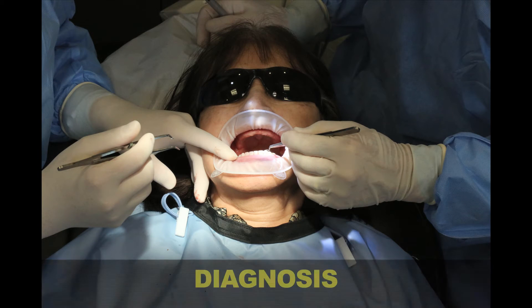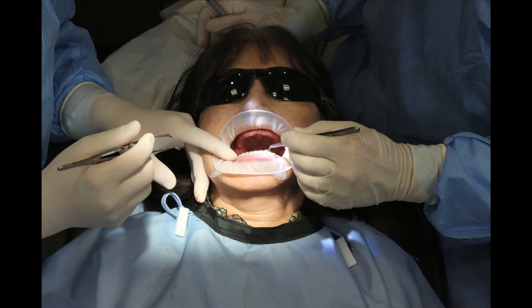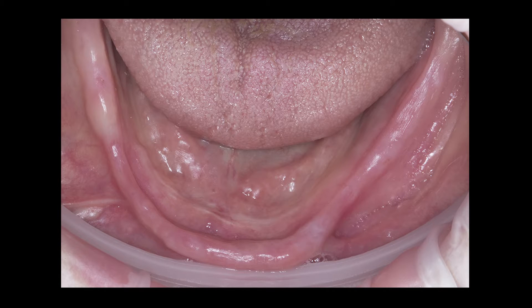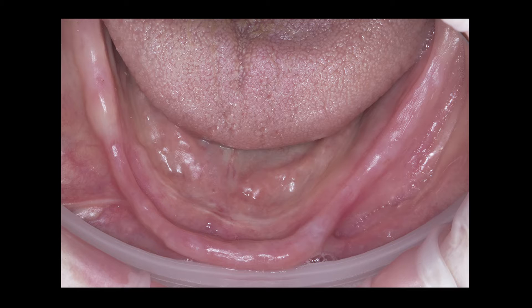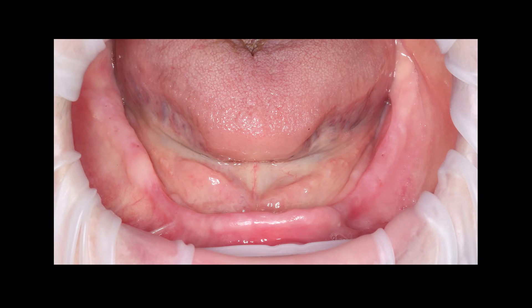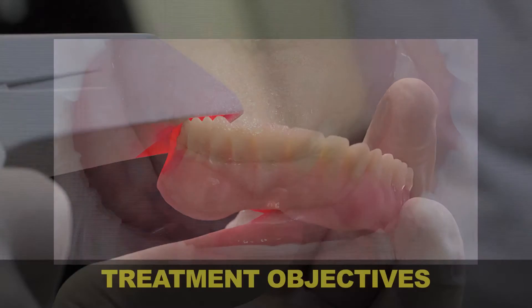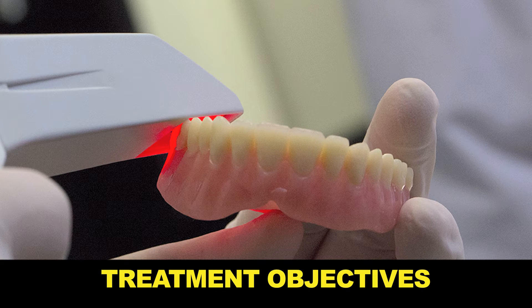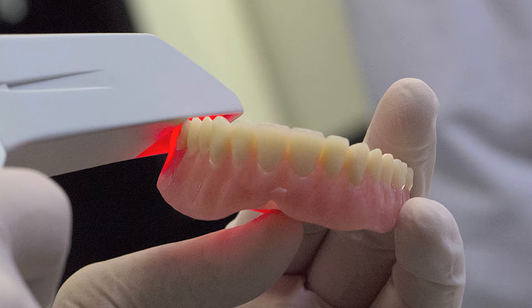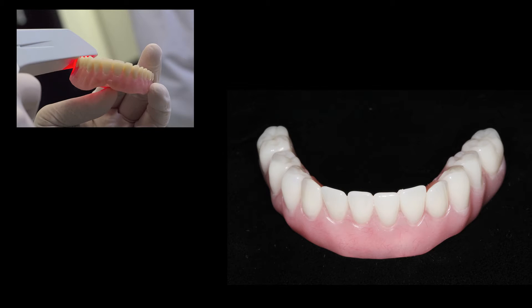Her periodontal tissues were generally healthy and free from irritation or bleeding because of recent reline and adjustment of the lower denture to relieve sore spots. Her occlusion with the relined dentures was good, and she had been functioning in these dentures for years without any TMJ issues. The objective of the treatment plan was to improve patient comfort and chewing function by replacing her existing mandibular denture with a screw-retained fixed implant bridge.